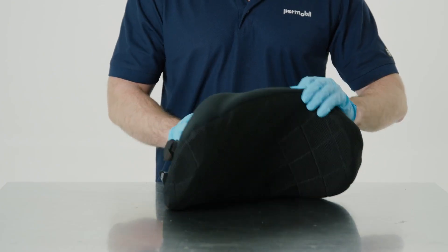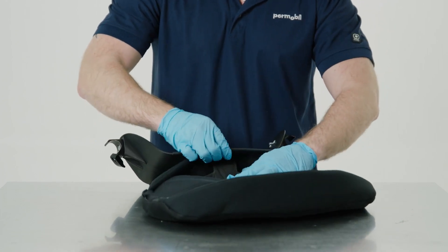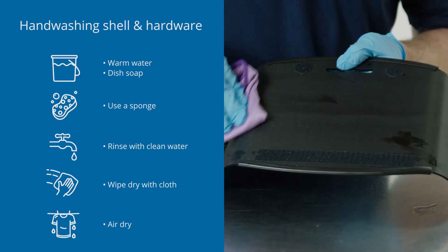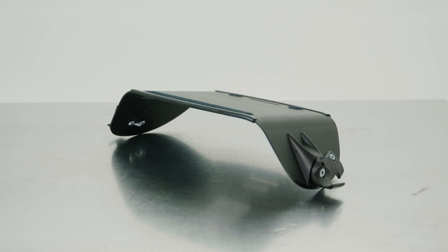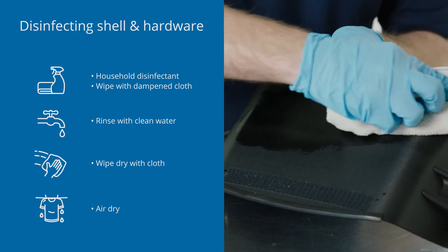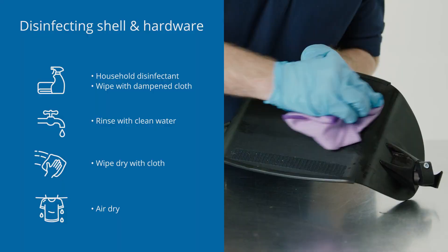Our back lines make cleaning and disinfecting a breeze. For our agility line of back supports, separate the inserts and cover from the shell. To clean the shell and hardware, hand wash in warm water with soap and a sponge. Rinse with clean water and wipe dry with a clean cloth before allowing to air dry completely. To disinfect the back shell and hardware after cleaning, wipe gently with a cloth dampened with household disinfectant. Rinse with clean water, wipe dry, and allow to air dry completely.